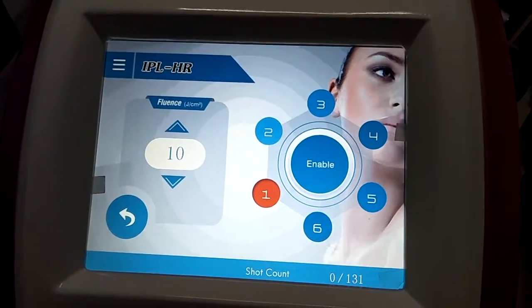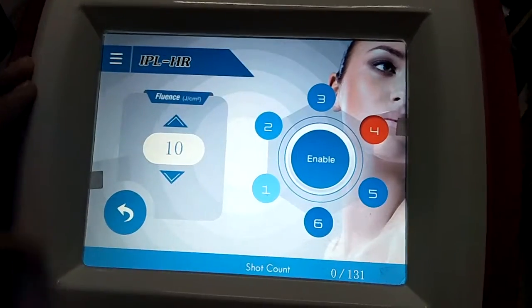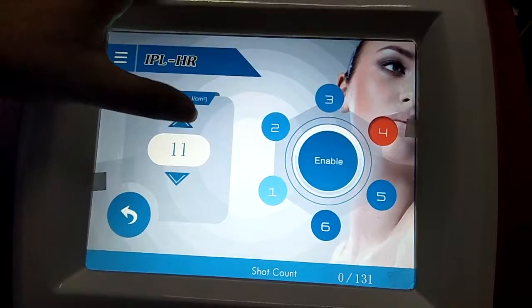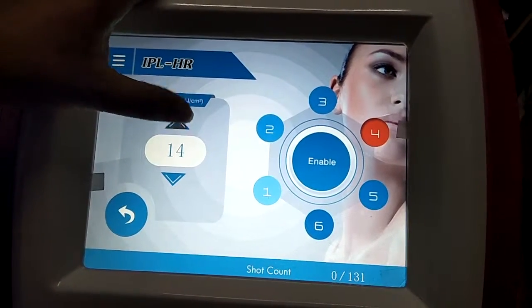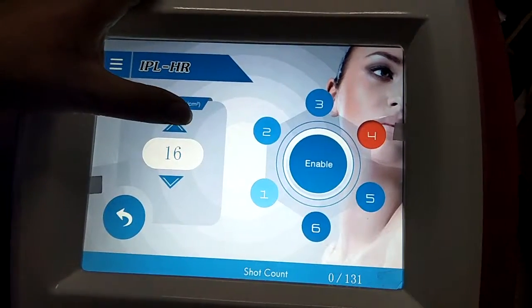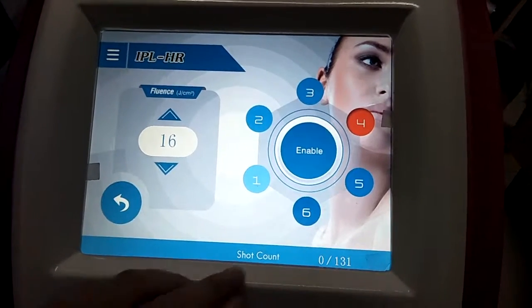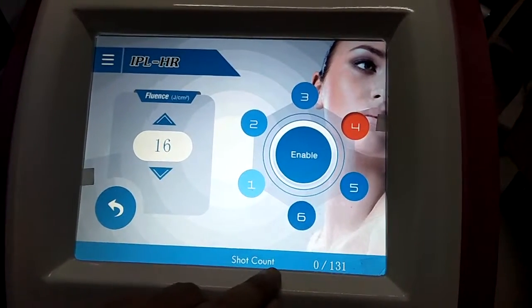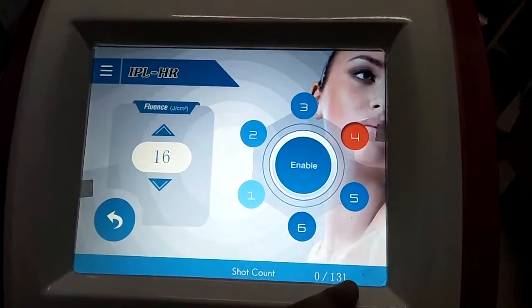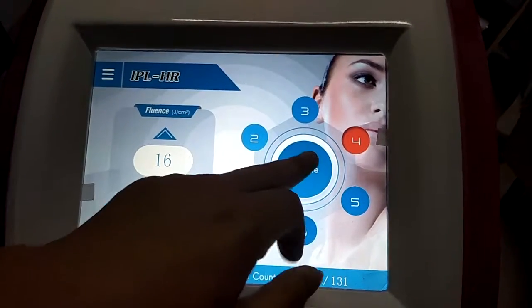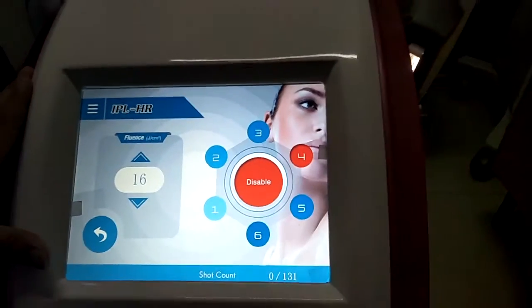For example, we can choose skin type 4 and adjust the energy. It can be adjusted from 10 to 50 — for example, we can choose 16. Here is the shot counter: the left is the current counter and the right is the total counter. We can adjust here.